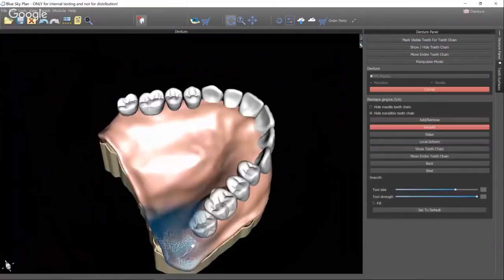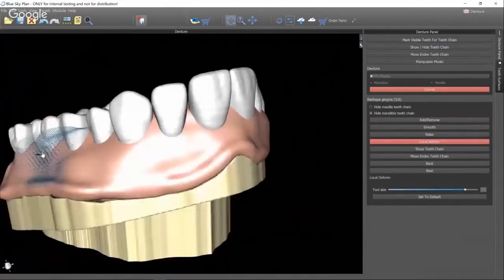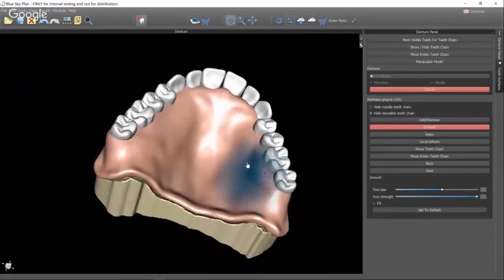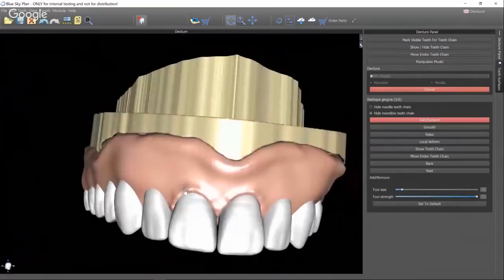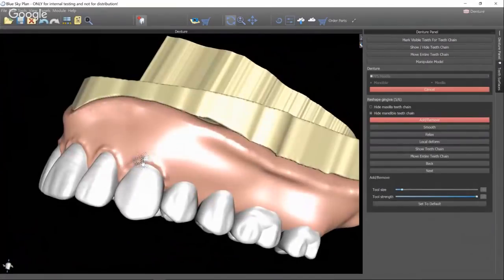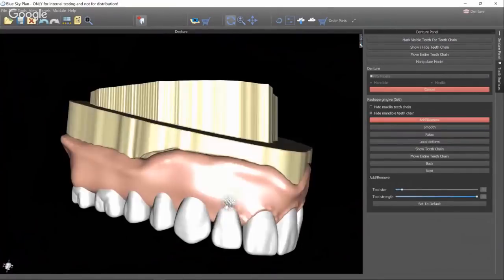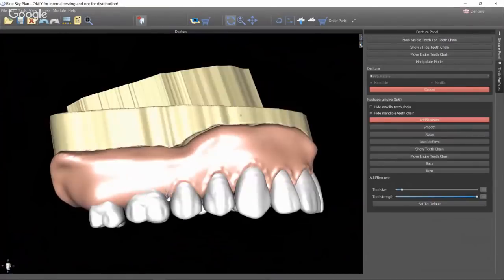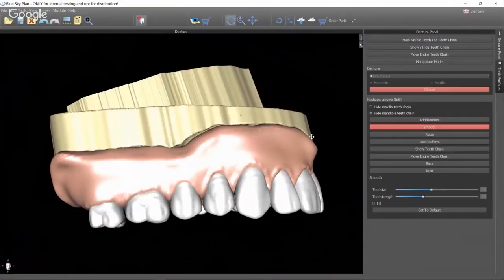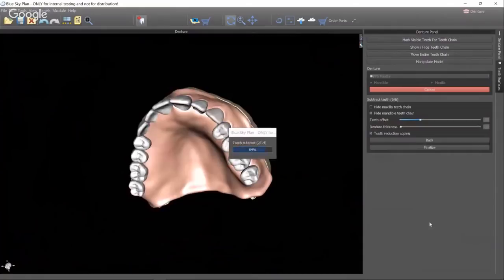So as you can see, I'm using the smooth tool. I'm dragging up with the local deform tool, covering up the necks of those teeth, smoothing it out. And then to generate that gingival roll, that's when I will use the add tool. Okay, so I'll turn up the strength, I'll get a relatively small brush size, and then I go right along the gingival margin, creating a raised area right around the gingival area to make the roll. And then once we do that, hit it with the smooth briefly. You can develop root prominences now, and now I am subtracting the base.